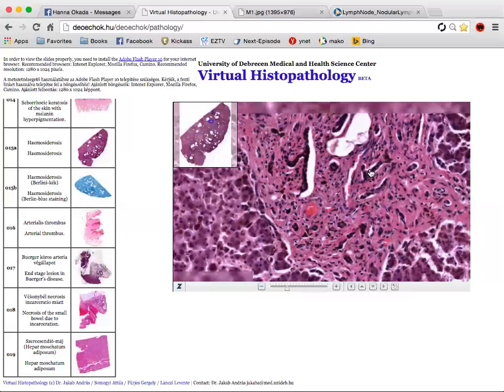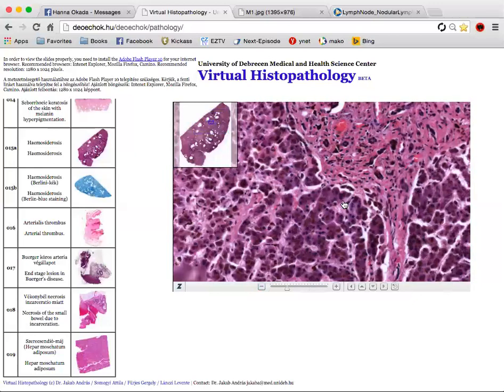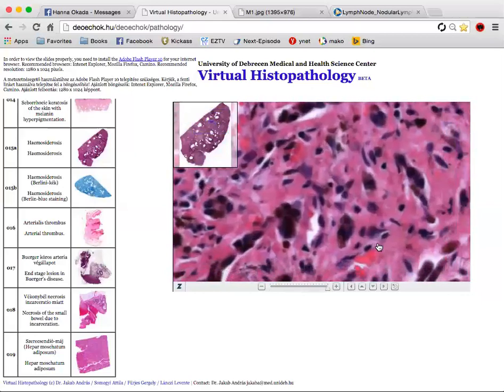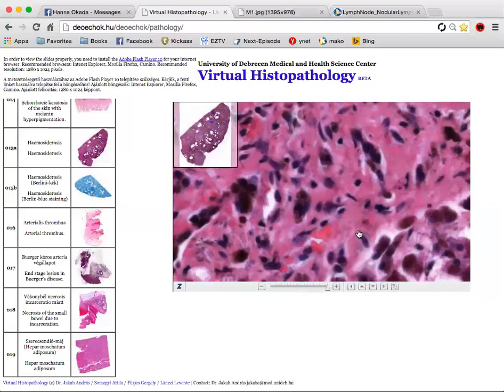But just the accumulation of all this hemosiderin here creates this stromal reaction. Like fibrinoid necrosis? No, it's not necrosis. It's fibrosis. Fibrosis is a process where fibroblasts release a lot of collagen. It's kind of scar formation? It's maybe a little similar, yeah. All right. Good.